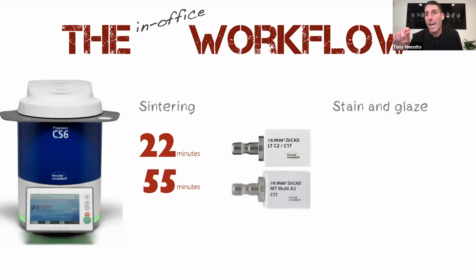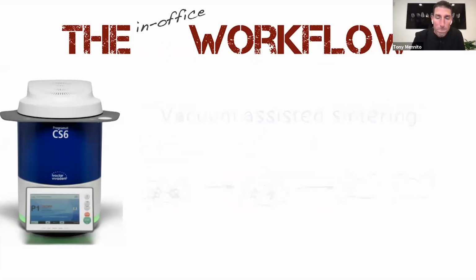Now, ZirCAD Multi is that more translucent, prettier, multi-layered material. So this is your more aesthetic option. And being that it's more aesthetic, and that's the expectation, it's going to take longer to sinter. Generally, the longer you sinter zirconia, the more translucent and the prettier it gets. There is an advantage to this oven that I'm going to talk about here in a minute. And like I said before, if you want to do an additional stain and glaze cycle, that's another 15 minutes.